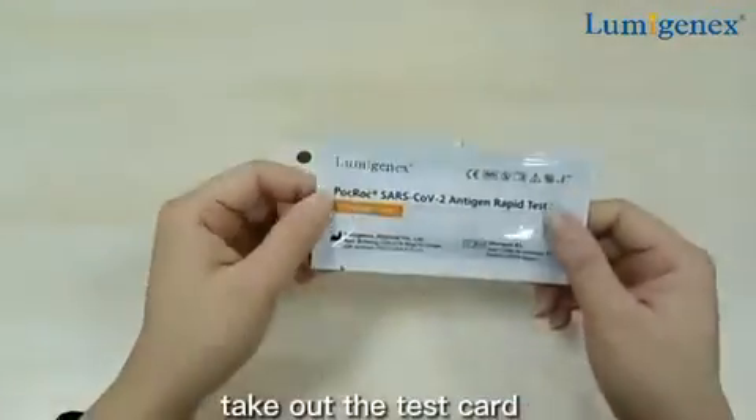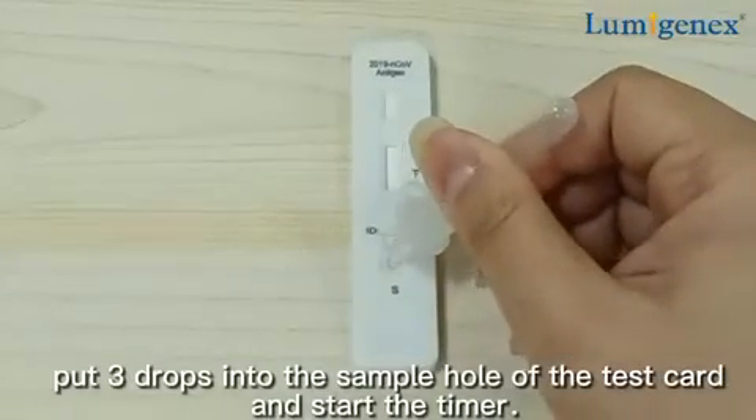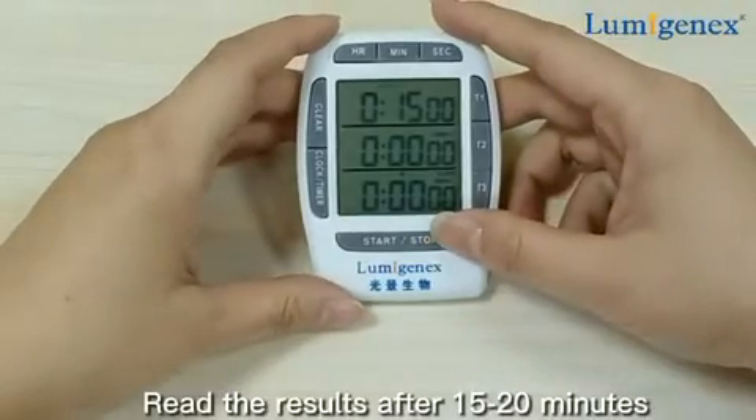Take out the test card. Put three drops into the sample hole of the test card and start the timer. Read the results after 15 to 20 minutes.